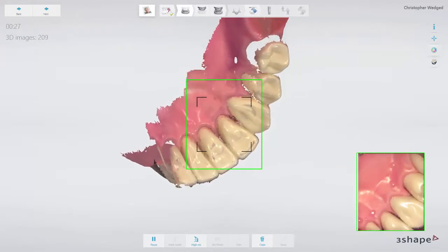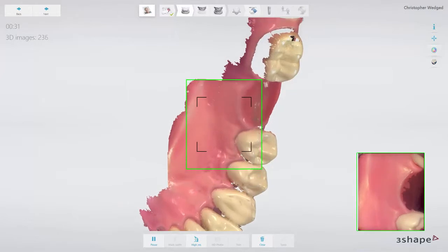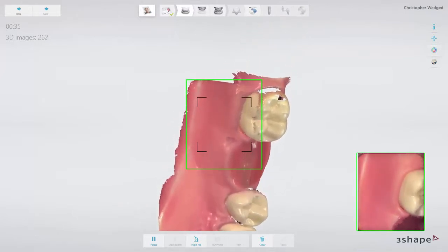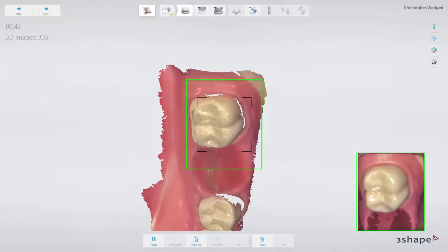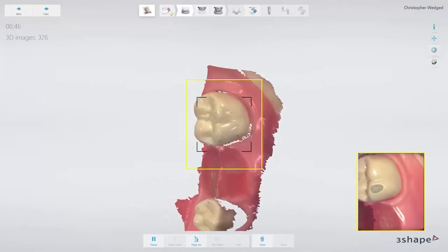When turning lingual, try to go as deep as possible, using the tip to push the tongue aside. If possible, with a 70 to 80 degrees angle, so that the scanner can grab images of the whole crest. Turn to the buccal side, covering the area behind the molar, the retromolar area, in case we need the support for the guide.